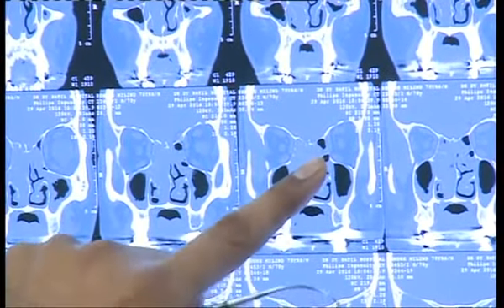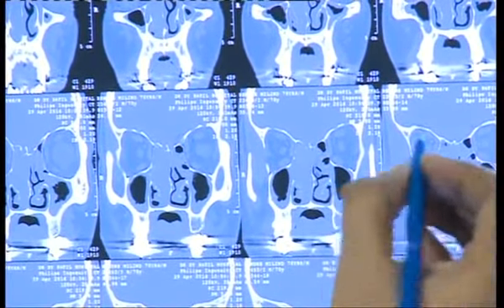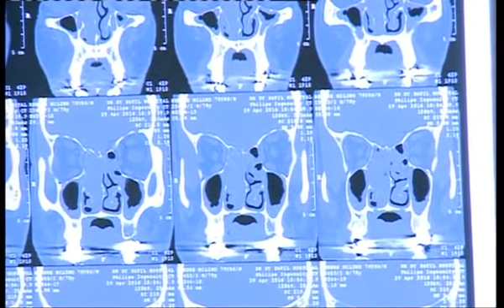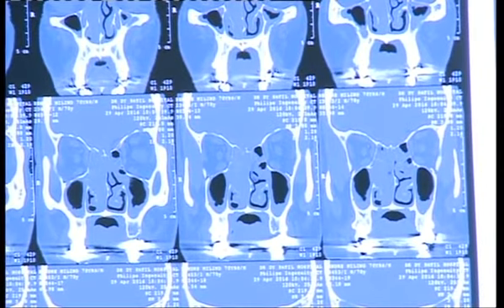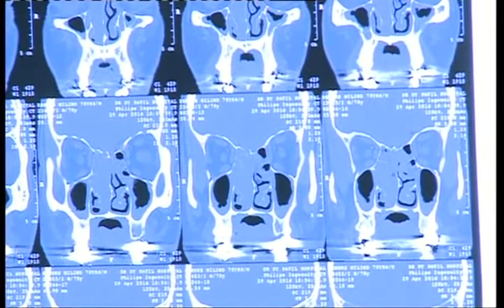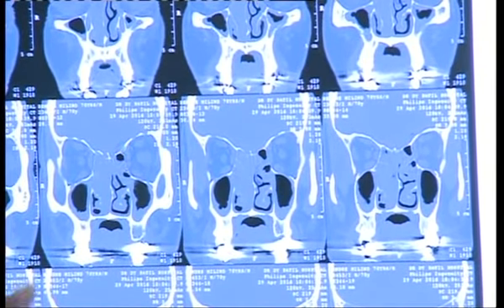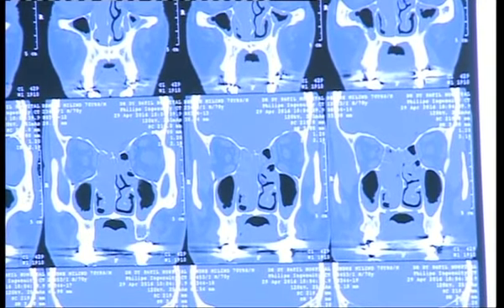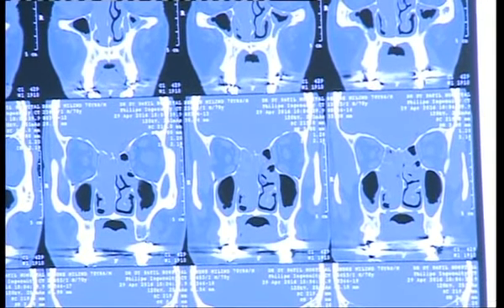It doesn't look like the cribriform now. And now see the next scan. That is the roof of the posterior ethmoid. So what does it mean clinically? It means a very short and narrow skull base, 5 millimeters, that I am going to show in the scan. The moment you see the anterior ethmoidal artery, the anterior ethmoidal roof ends. This is from the identification of this artery point of view.